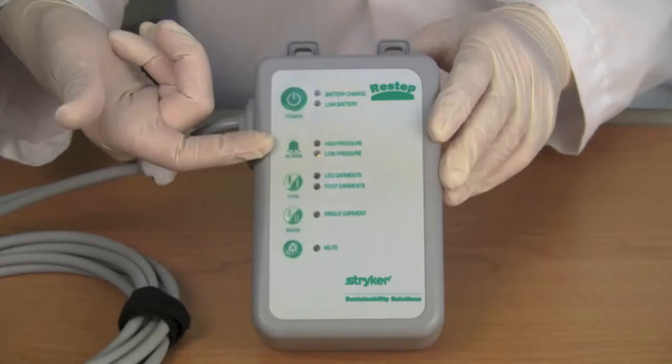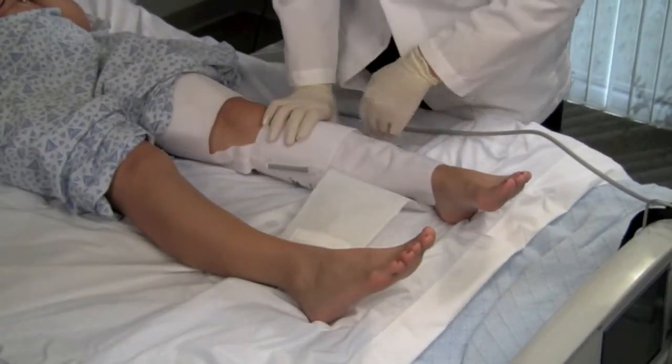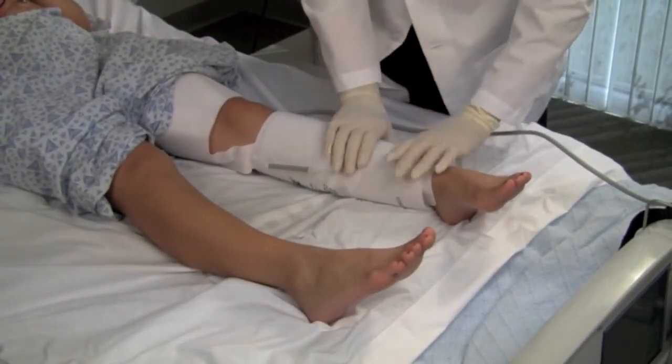The low pressure alarm is a solid yellow light with a constant audible alarm that will sound when no garment is attached or too loose. A solid yellow light will display with a beeping audible alarm if the pump is not providing adequate pressure to the garment. Check the garment for tears and replace if needed.